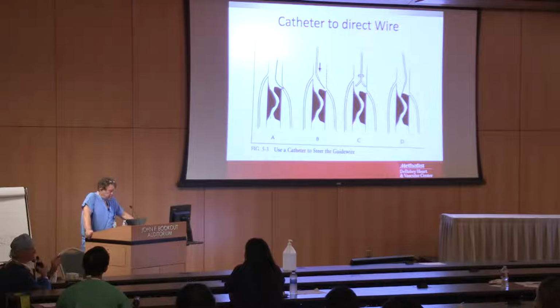And you will get someone who will pull a wire, we'll all pull wires out. It's much easier to pull out a lubricious wire, a hydrophilic wire is much easier to inadvertently pull out. That's why we don't typically, quote, work over a glide wire.